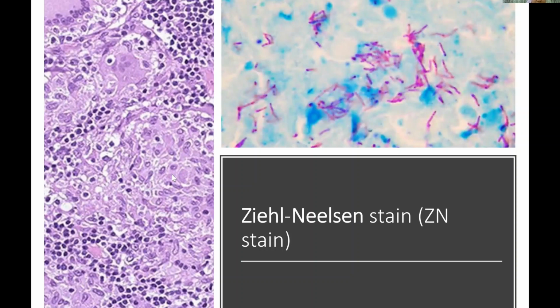aggregates of epithelioid macrophages here. This is all the epithelioid macrophages, surrounded by lymphocytes with scattered plasma cells. These are activated macrophages; sometimes we say activated macrophages have an elongated, slipper shape. And then we can see here a multinucleated giant cell, forming a horseshoe shape, which we call a Langhans-type giant cell. Normally when we see this type of giant cell with necrosis, it is most likely tuberculosis.